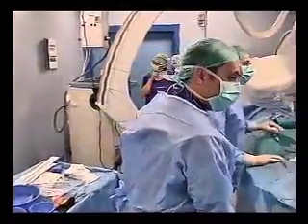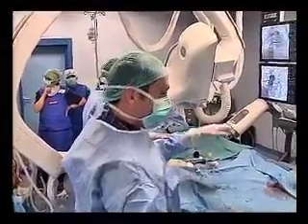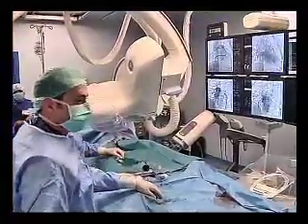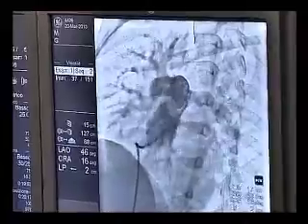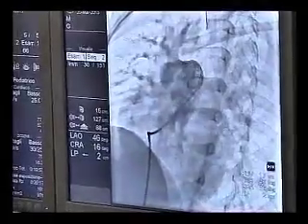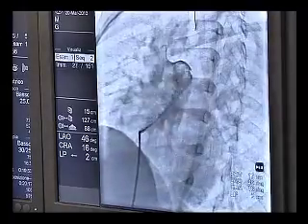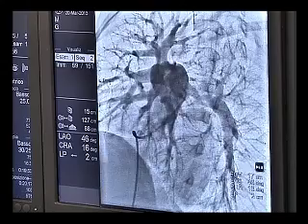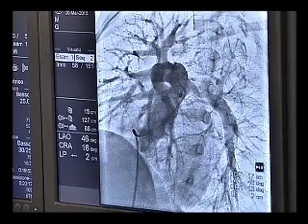Now I will present the angios we performed just a few minutes ago, just to see the left pulmonary artery stenosis, the moderate pulmonary valve regurgitation, and the discrepancy of the sizes between the pulmonary arteries. The right pulmonary artery measures about 10-11 millimeter. The left pulmonary artery measures about 2.8 millimeter in the stenotic segment and 8-9 millimeter distal to the stenosis at the site of the hilum.